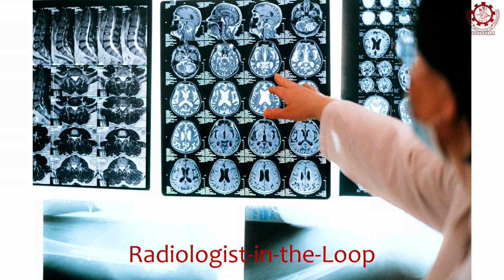First, let me tell you a little bit about what we mean by Radiologist in the Loop. Like we saw in the previous 2 sessions, if we build these models in silos, by that I mean we don't really consider the expert input, the domain expertise while building these models, the models will lack in some aspect when it comes to deployment in the clinic.